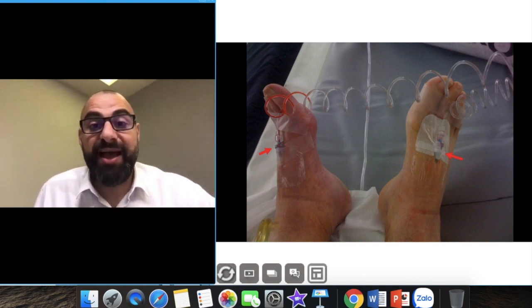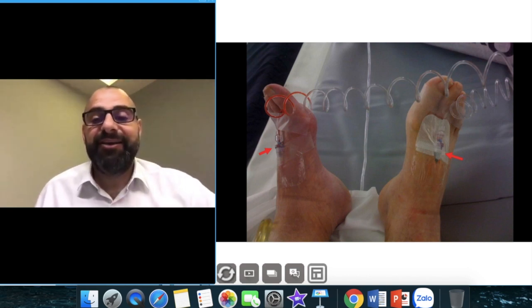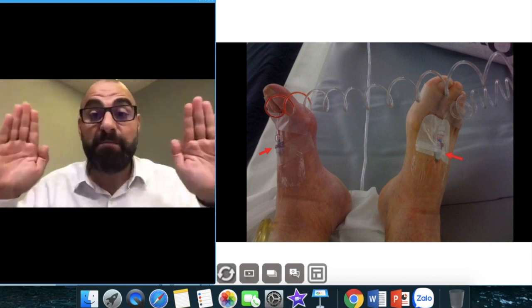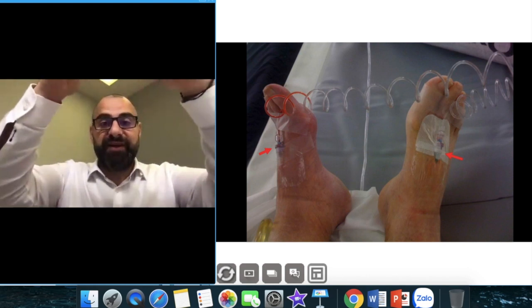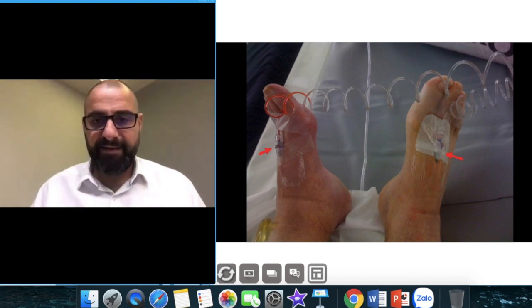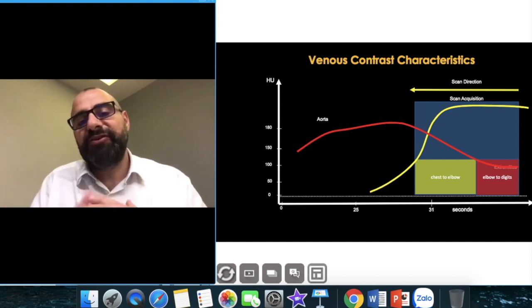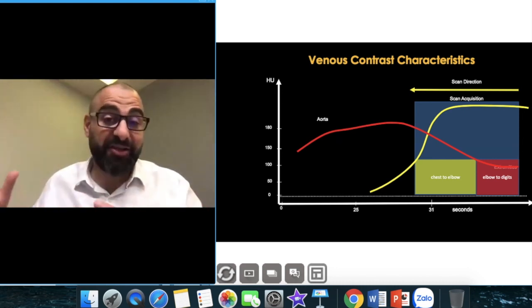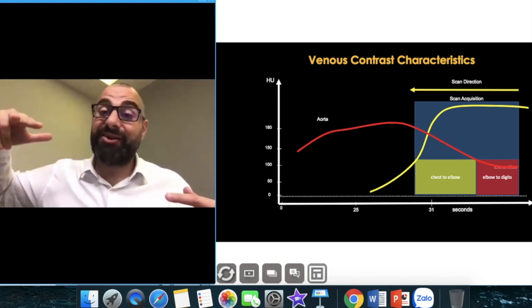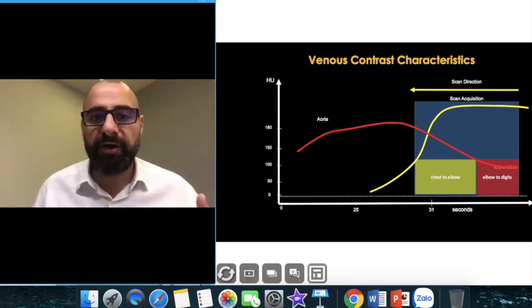I put a cannula in each foot. With blue cannulas you can go 2.5 ml/s. In each syringe, 30 mils of contrast and 70 mils of saline at 2.5–3 ml/s, injected both at the same time. As the contrast goes up and we see it in the inferior vena cava, we scan from the IVC down to the digits. Since we're doing direct venography — not indirect — we're injecting directly into the venous system. Once contrast reaches the IVC through the region of interest, scan top to bottom from the liver down to the digits.